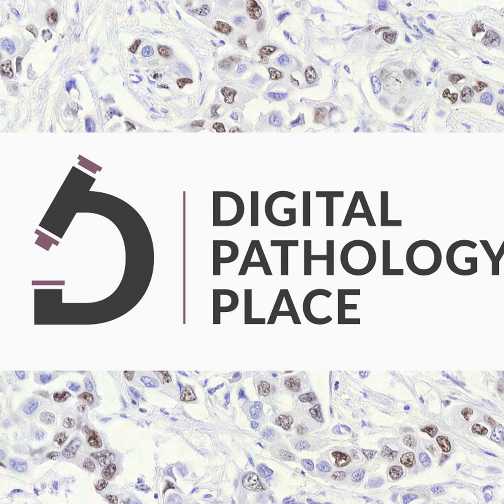So, the ground truth, the gold standard. Don, you mentioned before that we compared the multiplex to immunohistochemistry, to the stuff that came before that's similar enough and already regulated. But is that the best thing to compare it to? I have an analogy from AI image analysis development, when deep learning was entering the scene and pathologists were doing annotations.